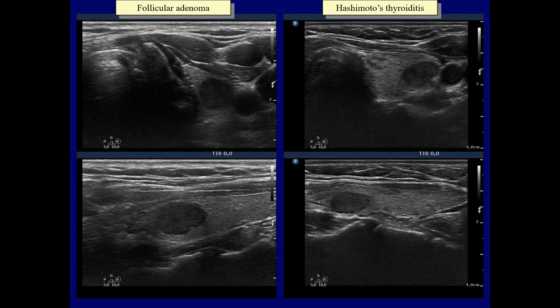There is one relatively large hypoechoic lesion in both cases. The only difference is that in the right case there are several smaller, similarly hypoechoic areas too. The latter raises the possibility of Hashimoto's thyroiditis but by no means excludes the possibility that the larger lesion would be a nodule in a pathological sense.